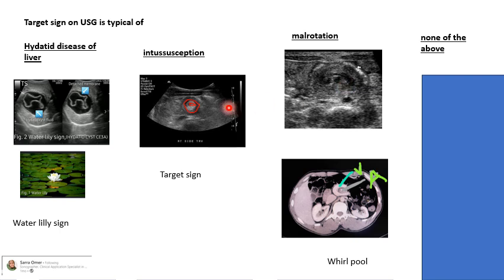With any imaging, it's very difficult for a student to be thrown an image and asked what it is. First of all, the student doesn't know where to even go and look in this big image, whether to stay in this corner or that corner. So they also give you clues so that you know more or less where to narrow down your vision. Keep that in mind. Look into the stem again and again when they are asking you for imaging spotters.